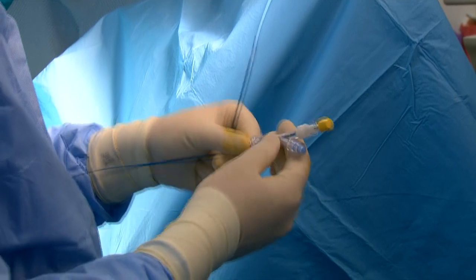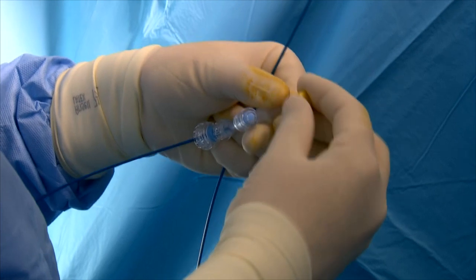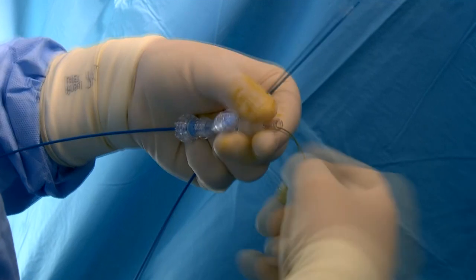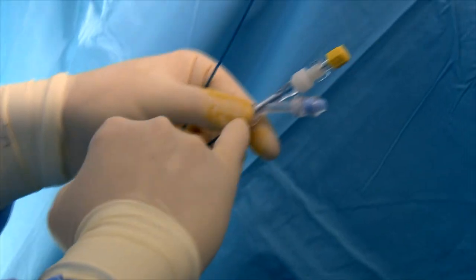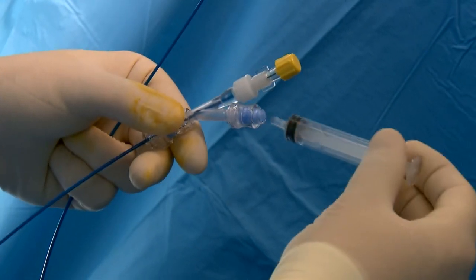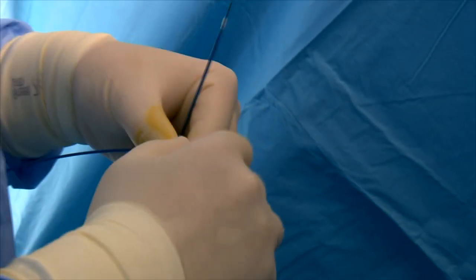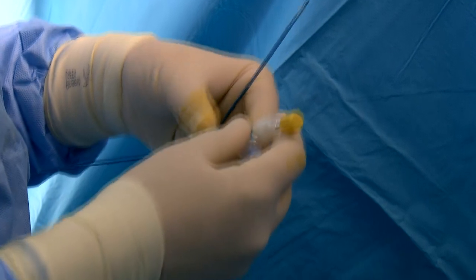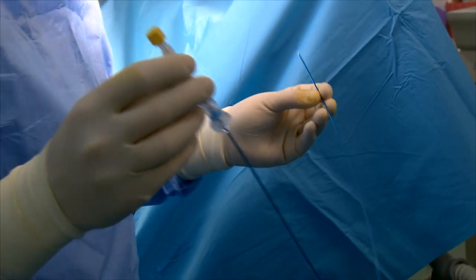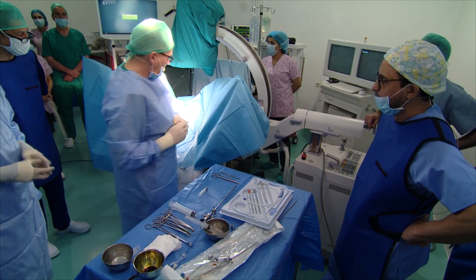The other end of this special balloon catheter has two ports. One is to remove the guide wire and to apply contrast dye through this channel. We show it later on. And the second one is inflation, to inflate the balloon. This can be done by a normal syringe, like this. And also you can remove it, all this half. Yes, you are completely right. We are going to show this later on. But this is really a nice device, and it facilitates the insertion of the balloon catheter. Now we can start the procedure. Okay, go ahead.